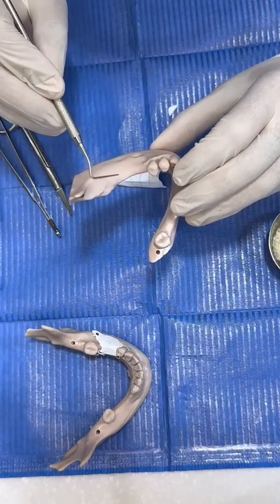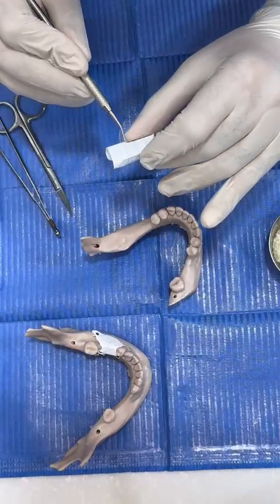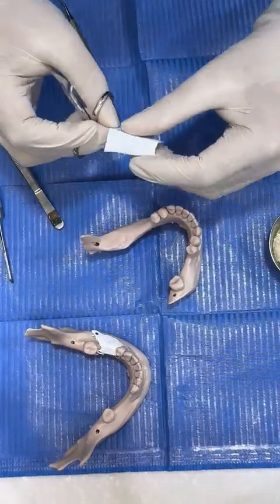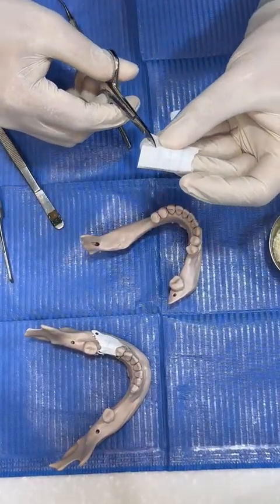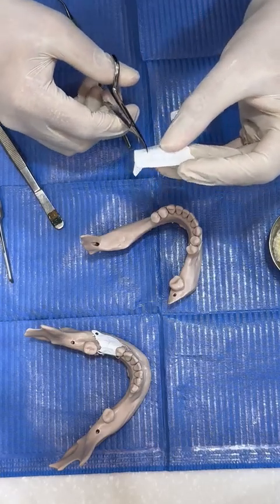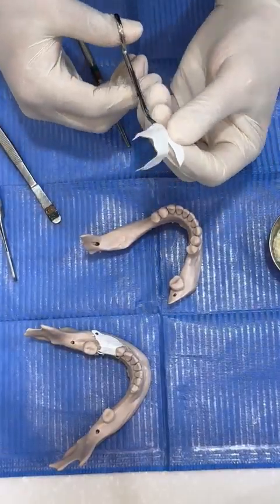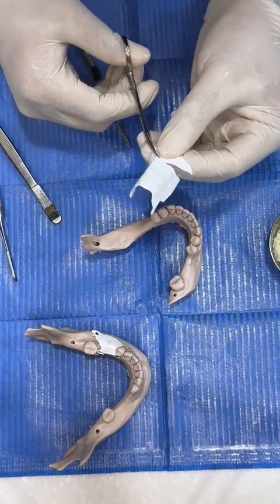I will add 5 more for the fixation. So here I see this is 15, and I can end with this line. I'll try to leave more edges of the membrane, because I will use them for the fixation.